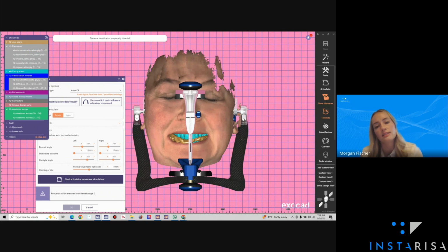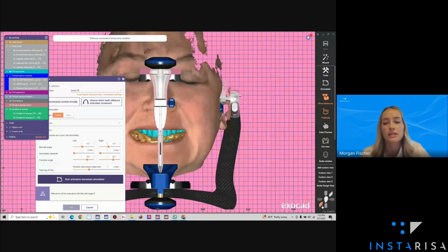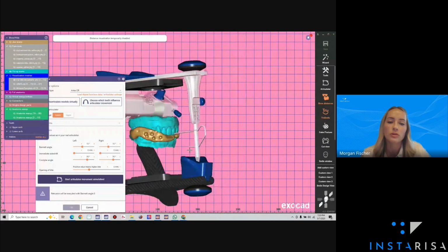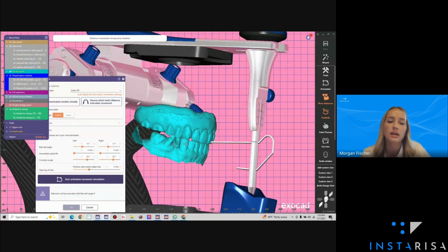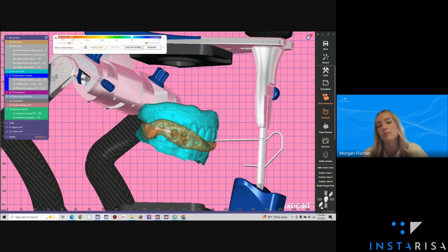It looks like this case is from Dr. Dave Dodrell in Montana. I love working with his team. They're great. So he has a ton of experience going to InstaRisa courses and opening bites. So it looks like here he took a putty bite and he opened just a couple millimeters, and I'll show you guys what that alignment looks like.